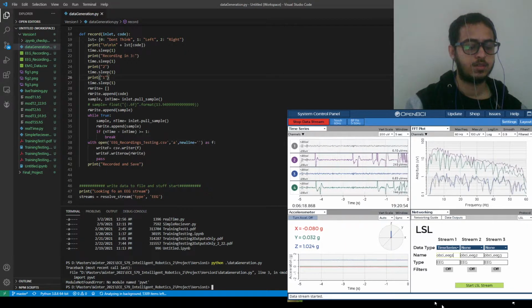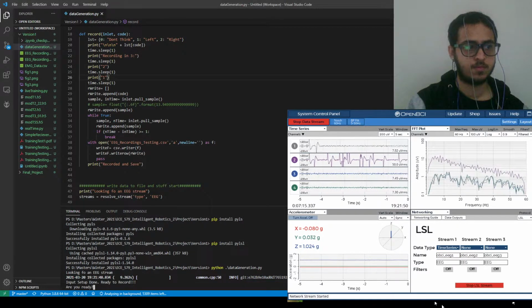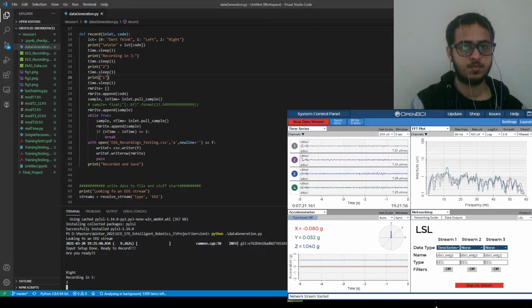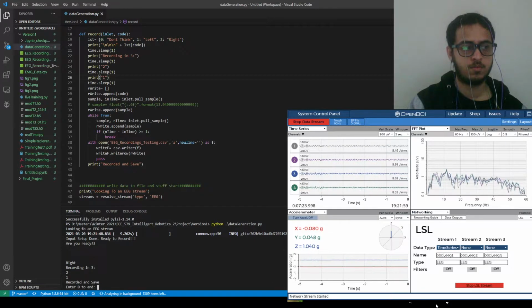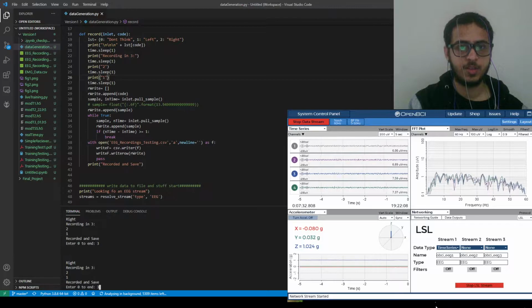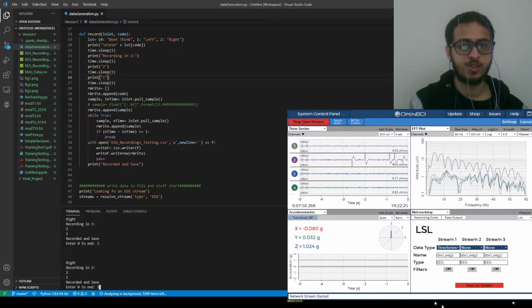Okay, so let's start it. I'll think of right. Let's go again. If you see, during recording there were some FFT fluctuations in some frequencies. Now I'm not thinking, and there are some visible changes between the thinking and non-thinking process. But there is some uncertainty between my left thinking and right thinking process.